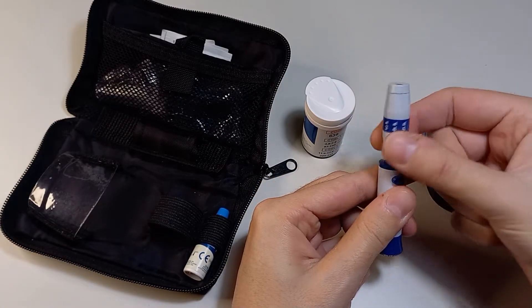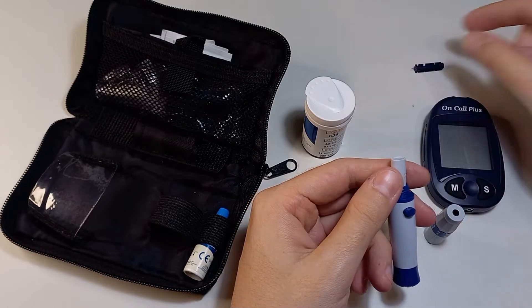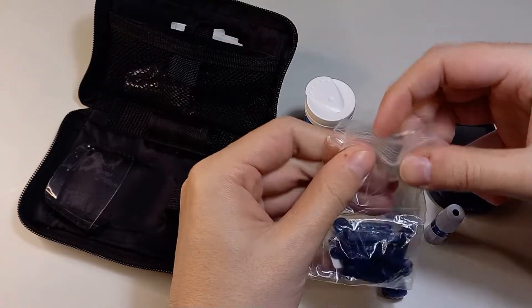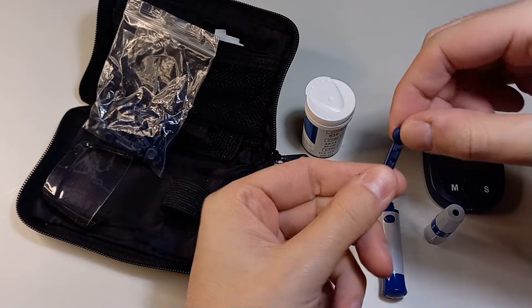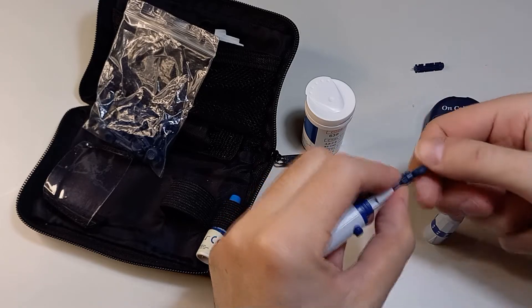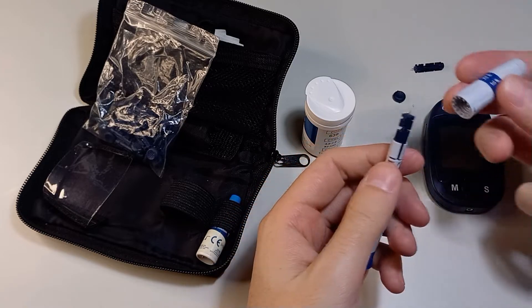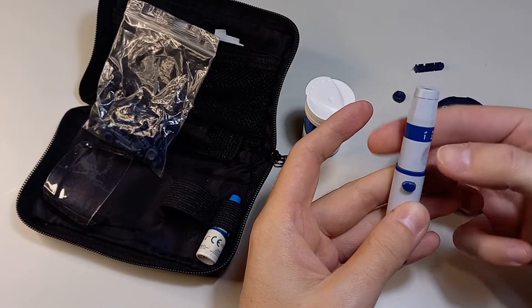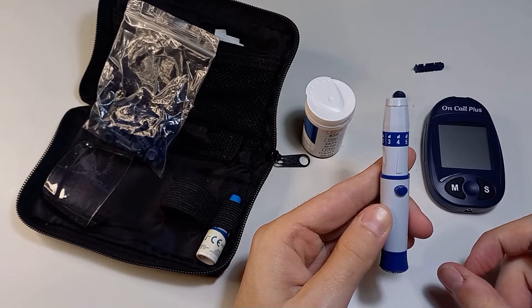To change the needle, unscrew the top part, then carefully take out the needle and discard it. Take a new needle, insert it into the slot, carefully rotate the plastic tab and remove it, then screw the top part back on. The needle should be changed after each finger poke, once a day, or once every one to two weeks. Most importantly, no one else should use the same needle.